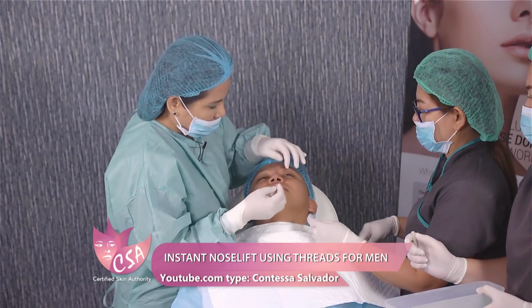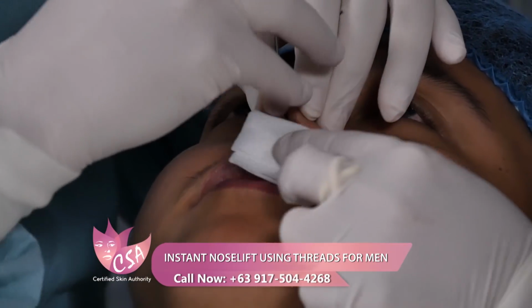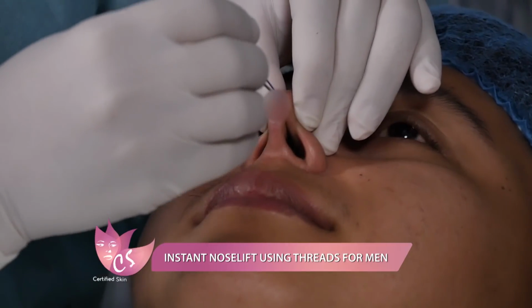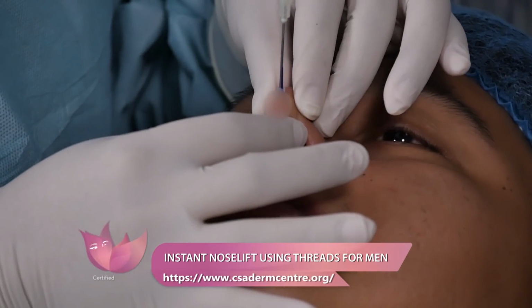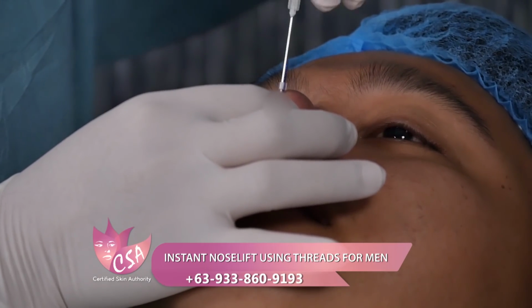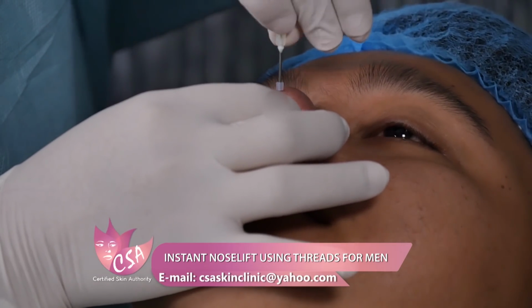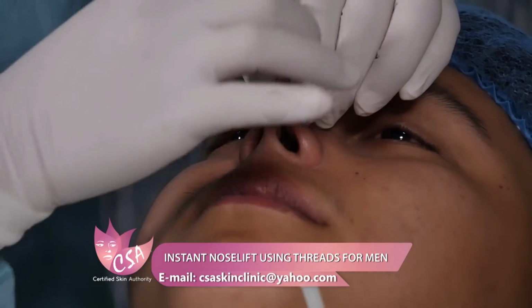So let us proceed to the nasal tip projection. I'll make another entry point into the tip defining point. Okay, and then I'll use my Wyco PDO 40mm here to project the nasal tip. Okay, I'll pinch the columella here to be able to grasp the cannula between the two fingers. So, some resistance here. Okay, inhale, exhale. Okay, there you go. Ideally, I have to reach that anterior nasal spine.